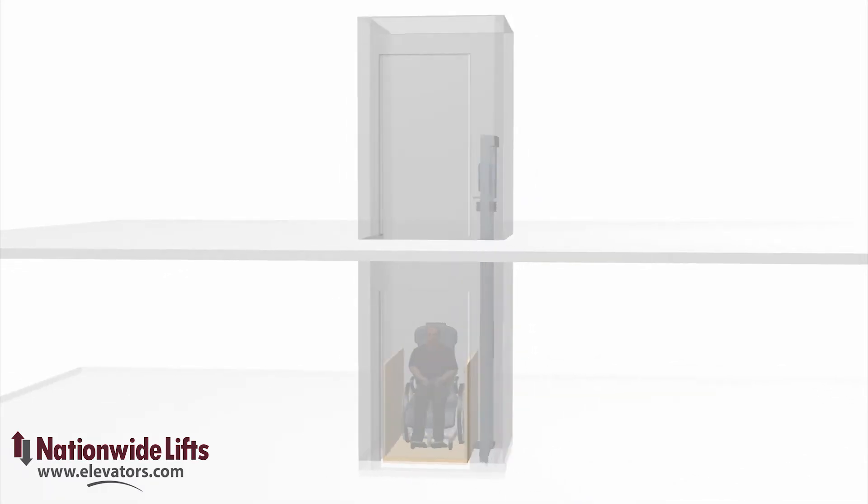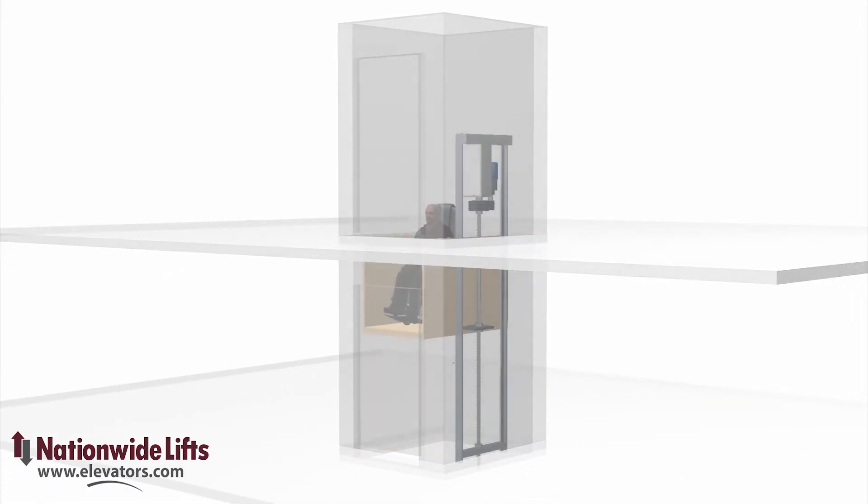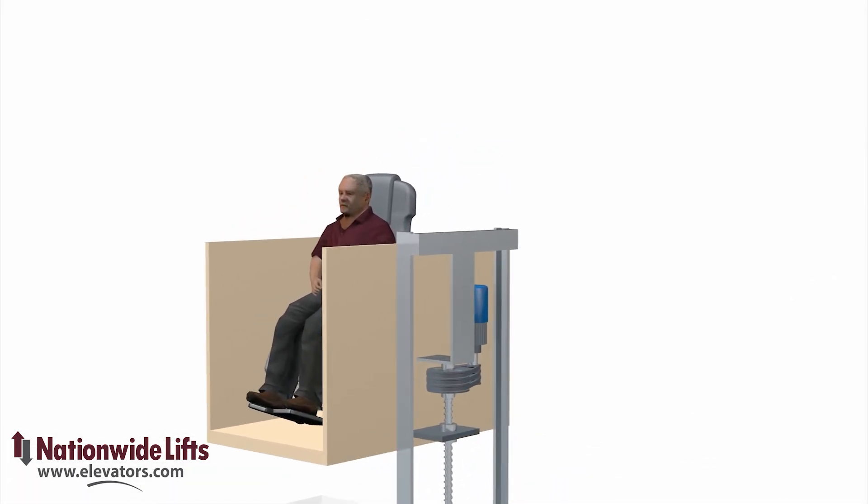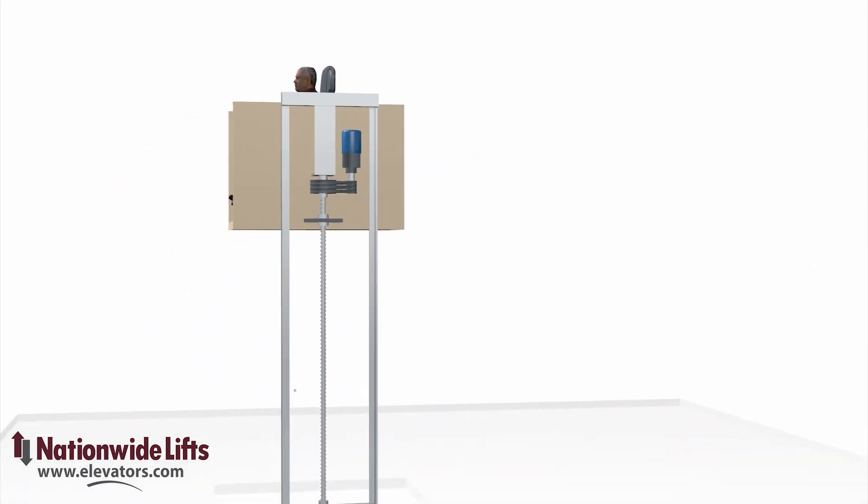An electric motor resides between the rails. It is connected to the screw shaft by belts. The drive nut is attached to the platform. As the screw shaft rotates, the drive nut and platform are moved up or down along the shaft.